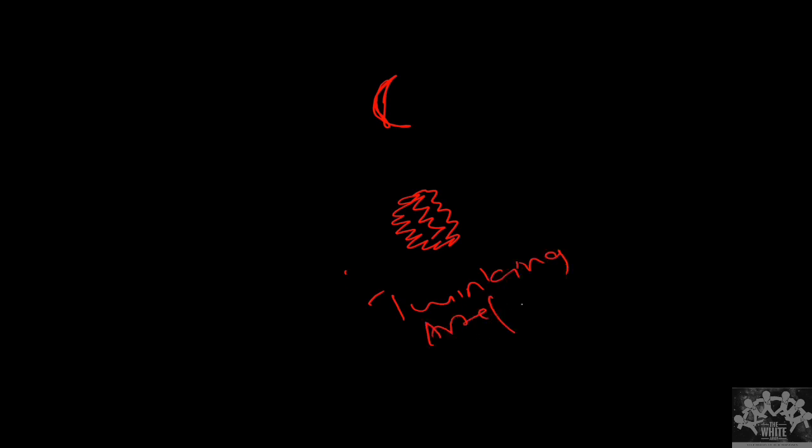Compared to the soft tissue, the fat will be slightly more reflecting. Now, how to differentiate air from the stone? The stone has a hard, irregular surface, and there is air here. Both are appearing whiter. Normally, there is one phenomenon called the twinkling artifact, which we see when I do a color Doppler.